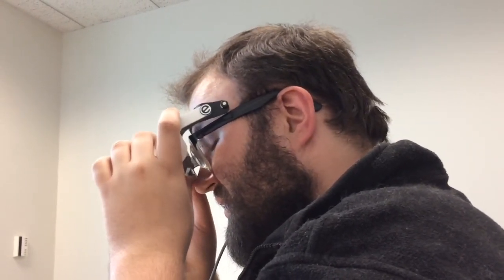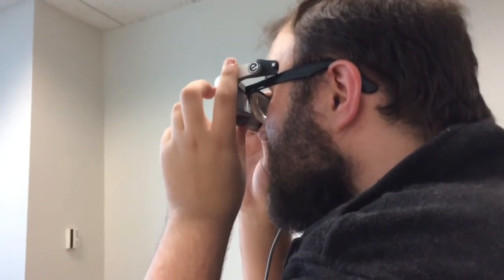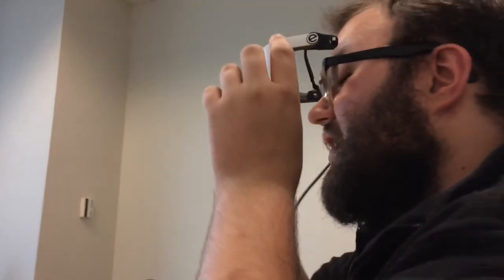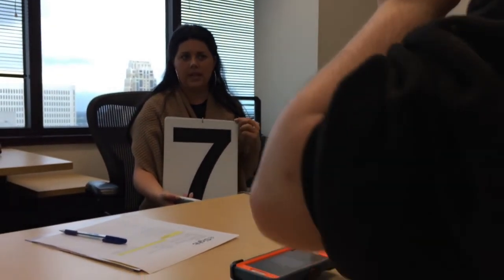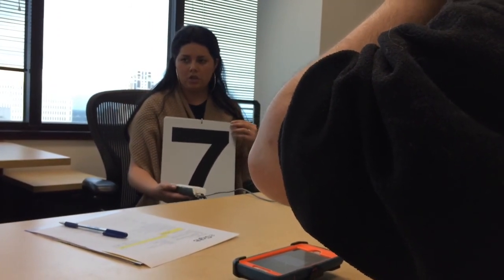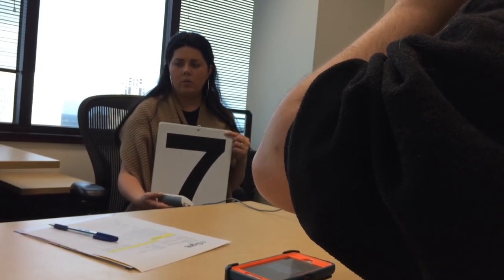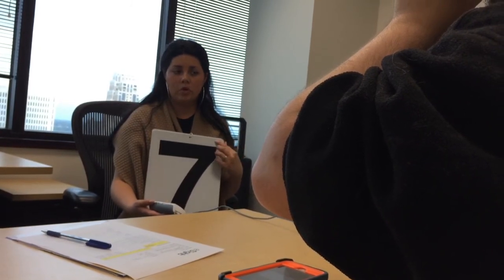The demonstrator wants to see if the user can read a chart she's holding, and zooms in quite a bit. She had zoomed in on Vicki before but backed out to give more field of view. She asks if the user can see the number she's holding. After a moment, the user identifies the number on the chart as a seven. The demonstrator confirms it is indeed a seven.